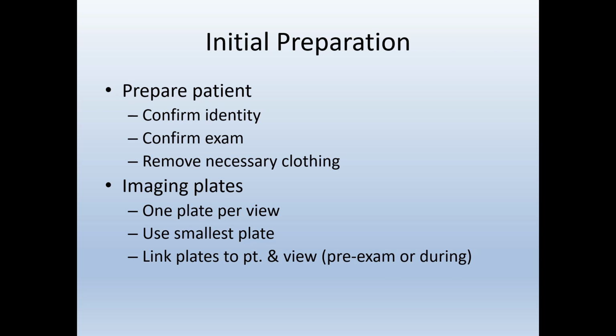Also, this is a good time to associate the imaging plate with the patient and with the view the plate will eventually contain. If you are unsure what the association process is, I will explain further in following slides. Finally, it is a good idea to set up the X-ray room before the patient enters. Center the tube to the bucky, lower the examination table if necessary, have any positioning aids ready at hand.